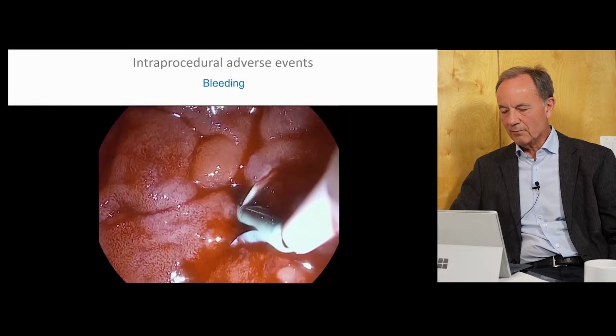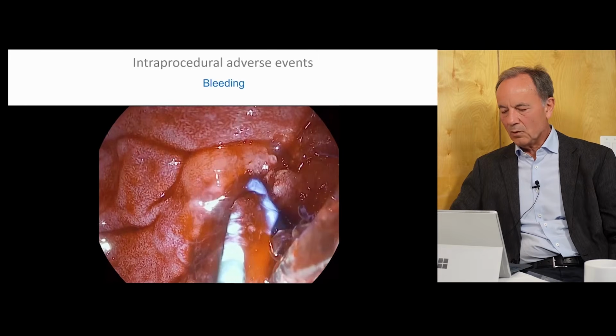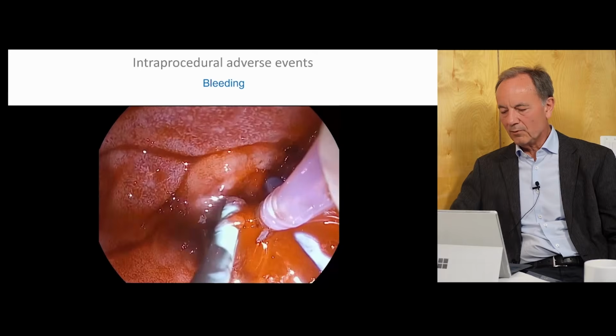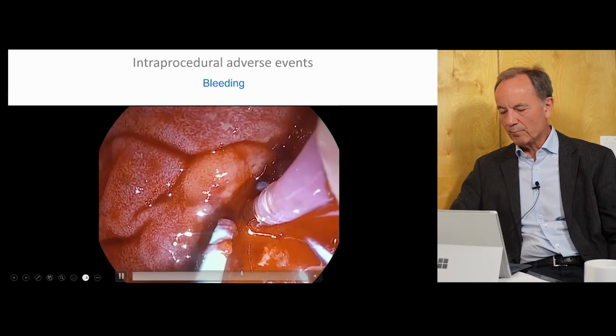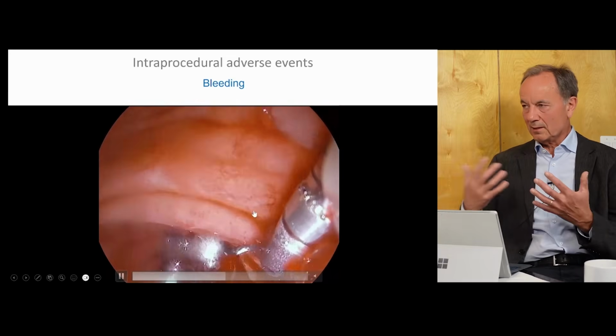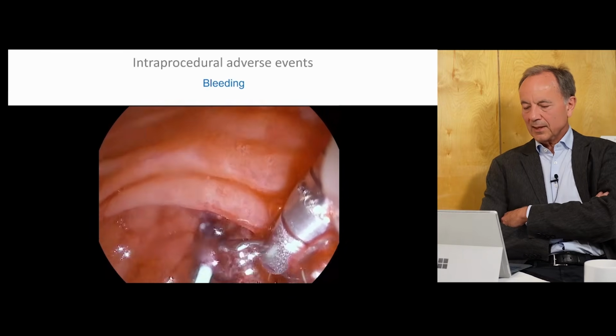5 French stent here with side flaps because I would like to minimize the risk of migration during further manipulations. But only 5 French. The bleeding is ongoing. Now we can do electrocoagulation. So as mentioned before, I coagulate. In this case, I also place the biliary stent, because once we inject a lot and manipulate, then you can also block the CBD.